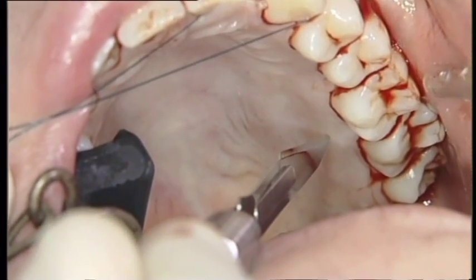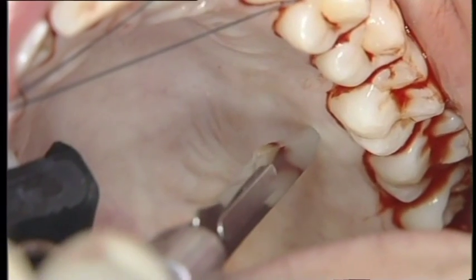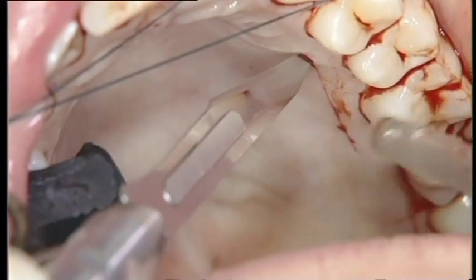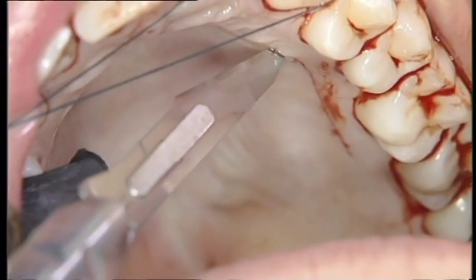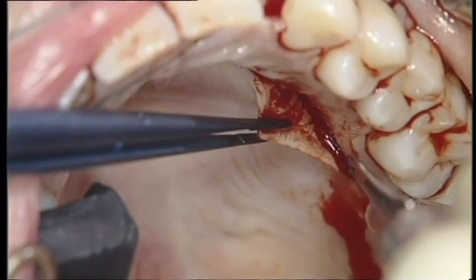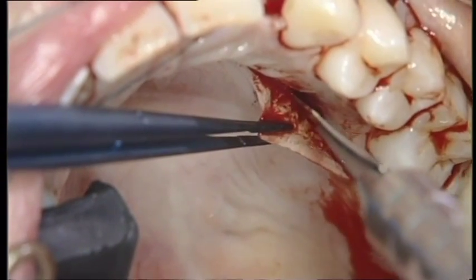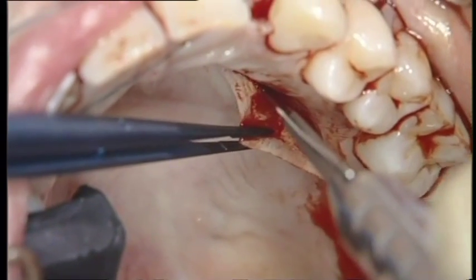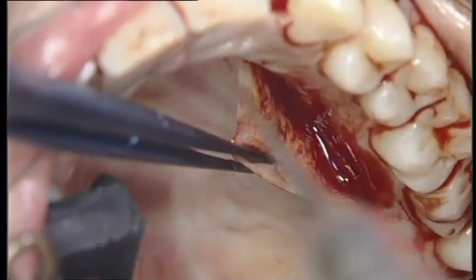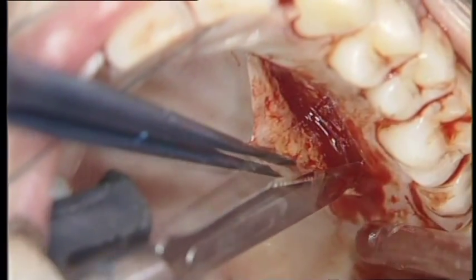A superficial line incision is made on the palatal mucosa from the first molar to the premolar sites. In the canine area, the incision is curved towards the mid-palatal aspect to create a triangular flap. A split-thickness flap preparation goes from the initial incision towards the mid-palatal aspect. Now the connective tissue graft is cut along the initial incision.